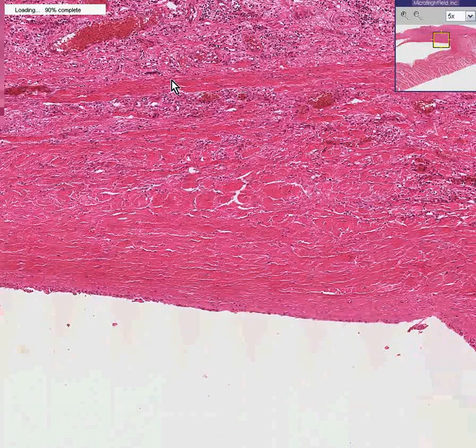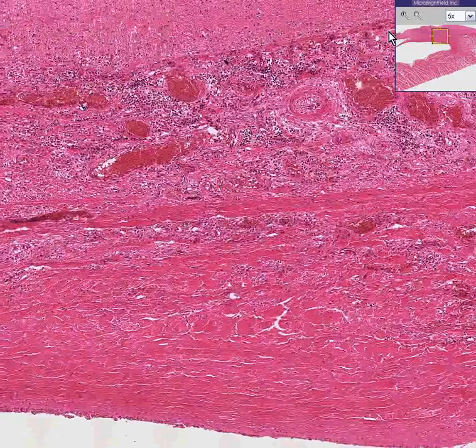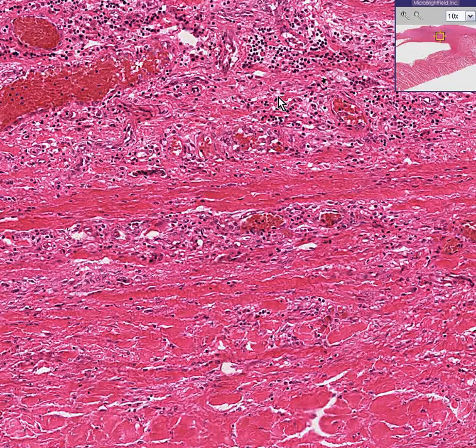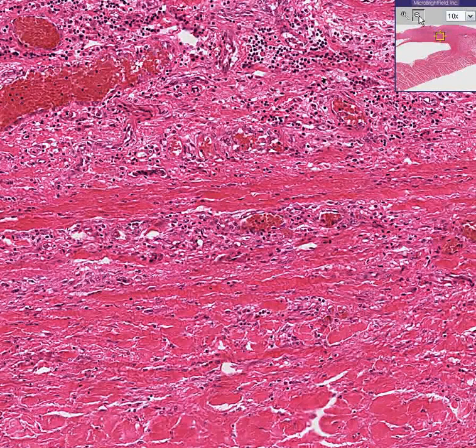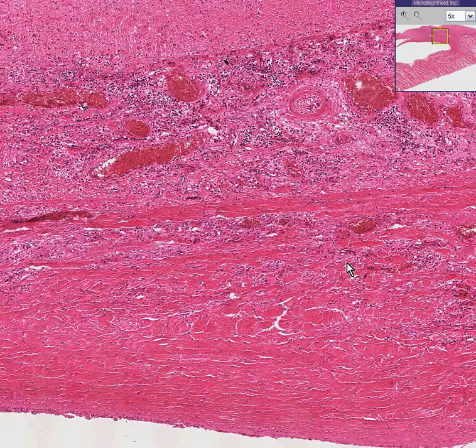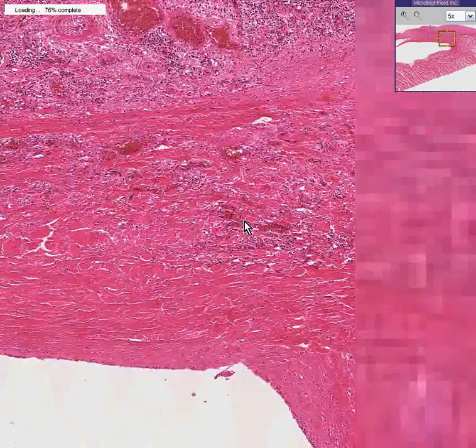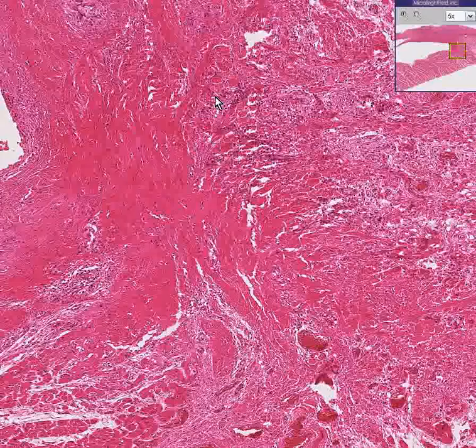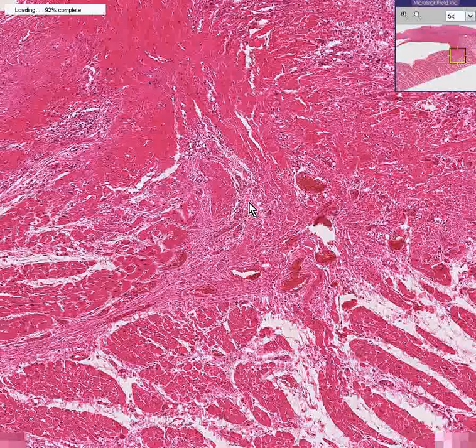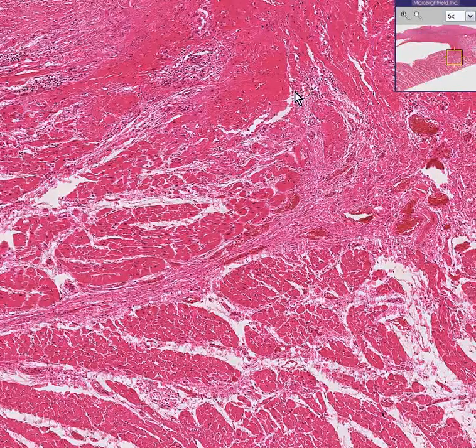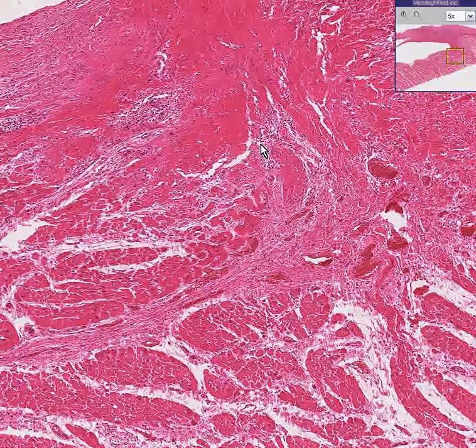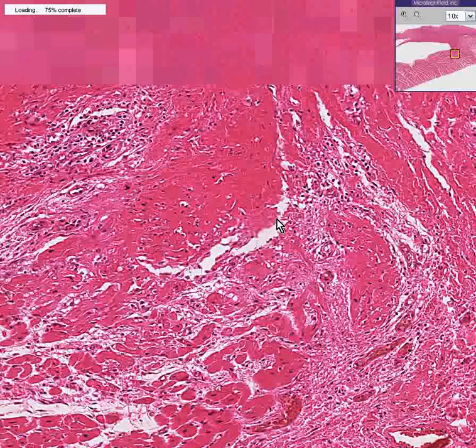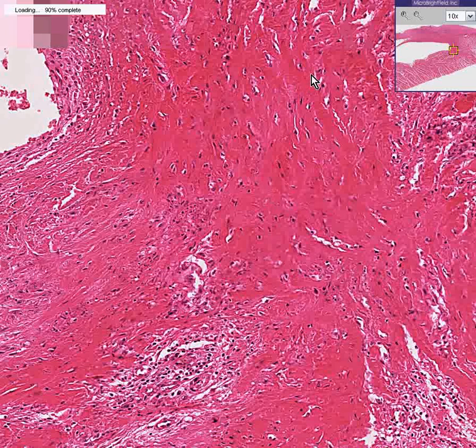This is a heart valve which has been damaged by rheumatic fever. In this case you could see that even though some of the myocardium out here may have some inflammatory changes very subtly, the area of greatest damage and inflammation is here in the endocardial portion, which is the valve.